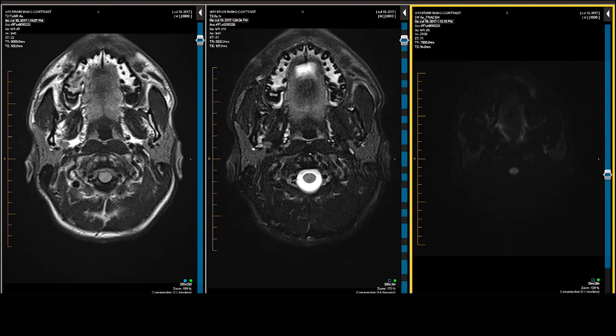On T2-weighted scanning, demyelinating plaques are better seen in the infratentorial area. So initially we look at the cerebellum and brainstem on the T2-weighted scan. Then as we shift to the supratentorial space, the FLAIR scan becomes the dominant, most accurate way of evaluating because of the Virchow-Robin perivascular space issue. I also have the diffusion-weighted scan up to look for active demyelination with cytotoxic edema, and to exclude another entity such as a stroke that could be simulating multiple sclerosis.